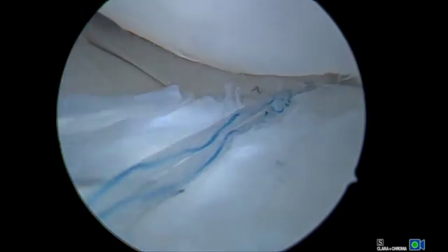All sutures are tied through the inside-out incision underneath the IT band directly against the capsule in a reduced position. Here is an example of the final repair. Following repair, incisions and the knee joint itself are copiously irrigated. PRP is injected at the repair site.